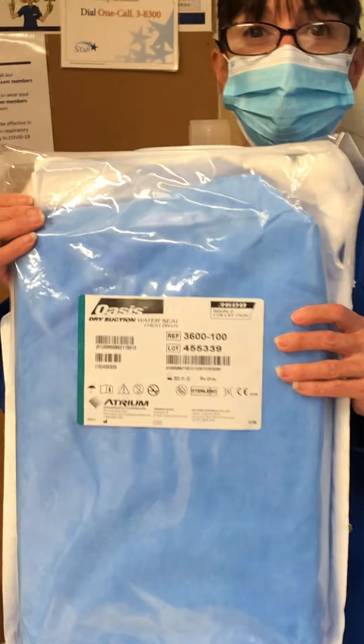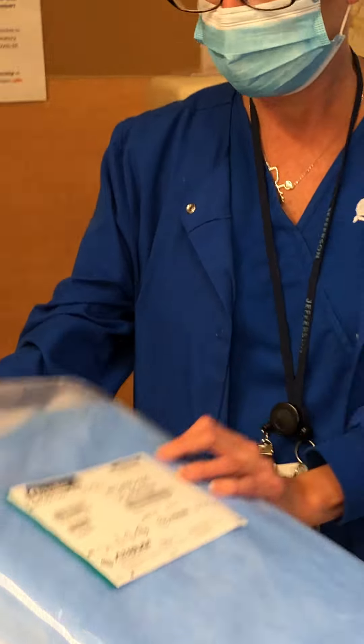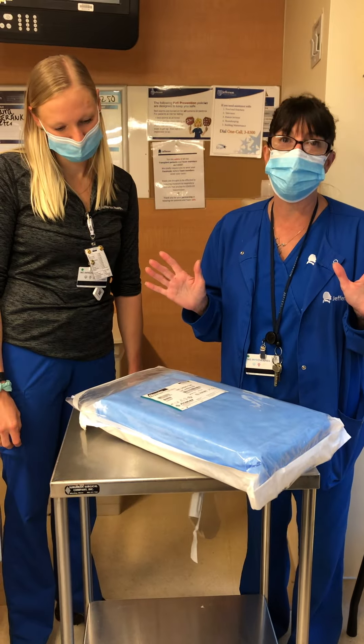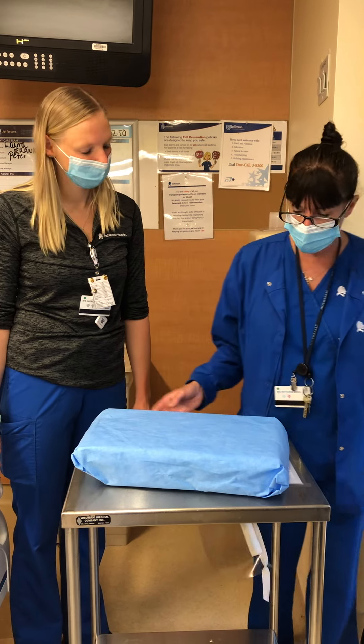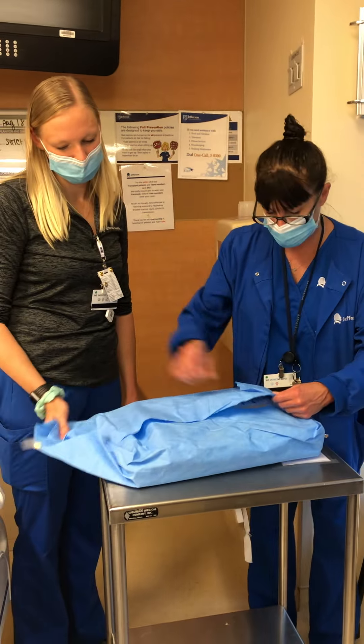Here's the chest tube. It comes from SPD in this package. First, of course, you want to wash your hands. Take the chest tube out of the package.